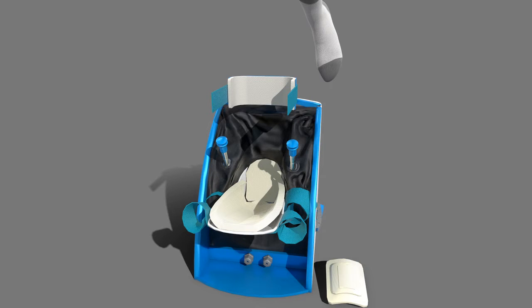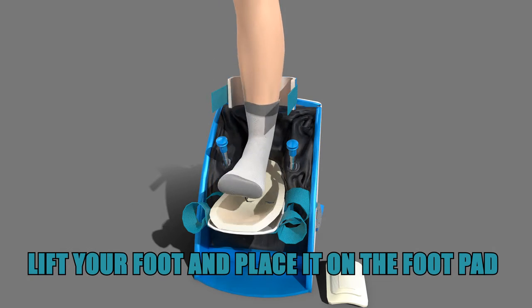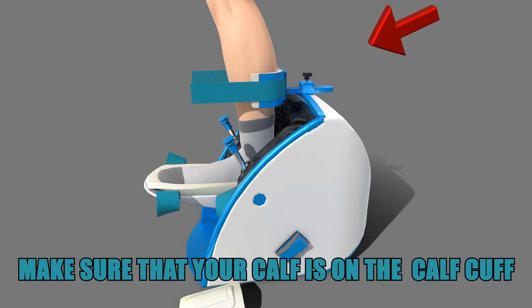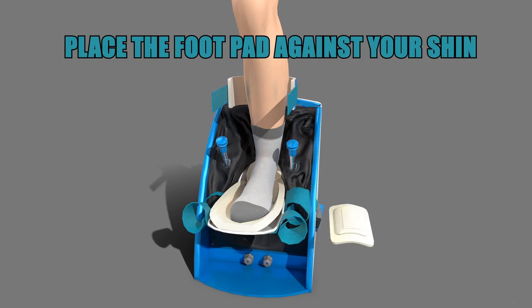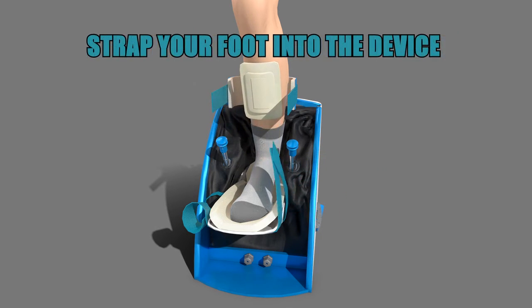Once we have the Velcro straps undone, we can now position our foot into the device. Lift up your foot and place the foot against the foot pad of the device. Make sure that the back of your calf is against the calf cuff. Place the foot cover on top of your foot and then use the blue straps to wrap around the foot and foot cover.